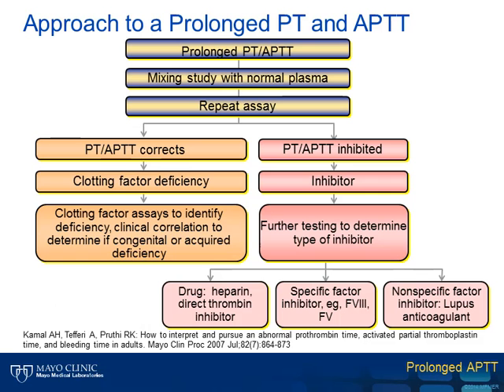The last slide shows an algorithmic approach that we pursue at Mayo Clinic in the Special Coagulation Laboratory. This was published in the Mayo Clinic Proceedings in 2007 and is available online for additional study.